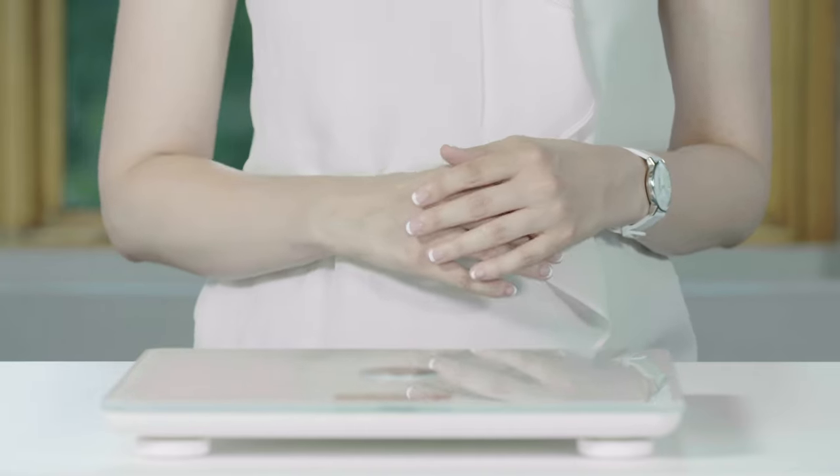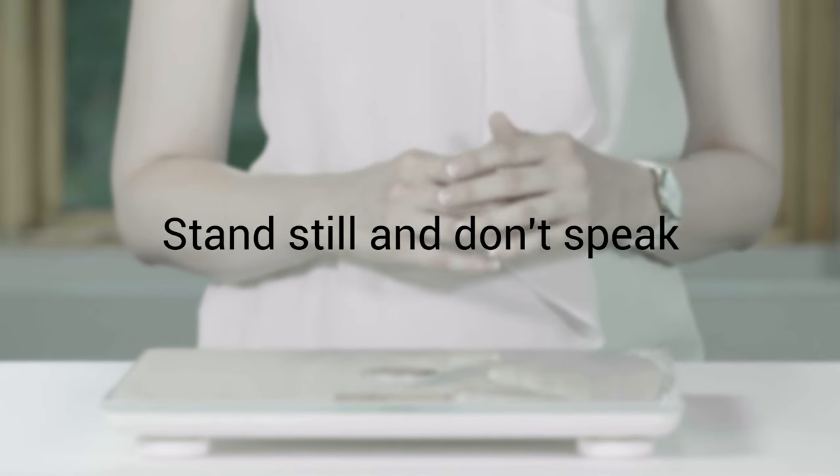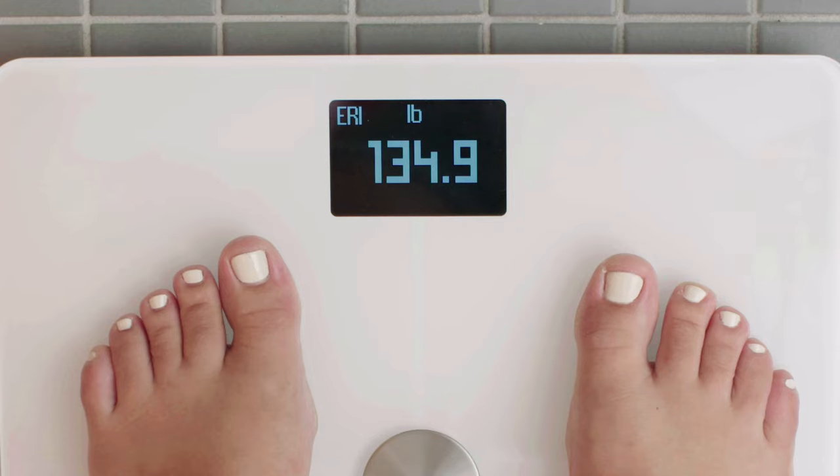For accurate measurements, be sure to stand still and not speak while the measurement is being completed. Once your body composition measurements are completed, they'll appear on the screen.